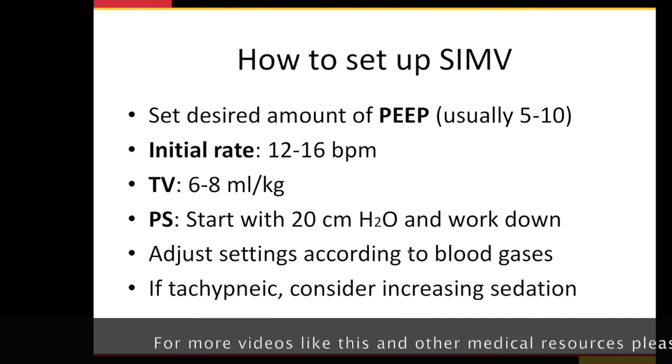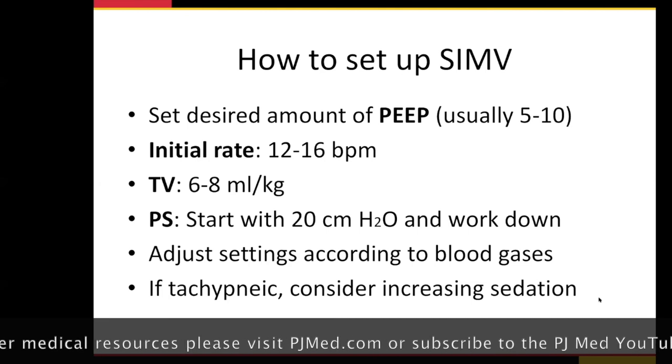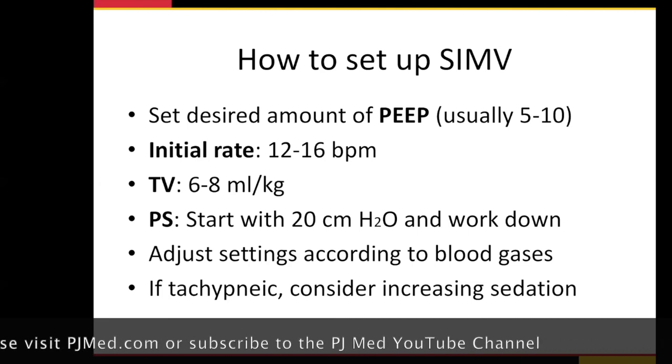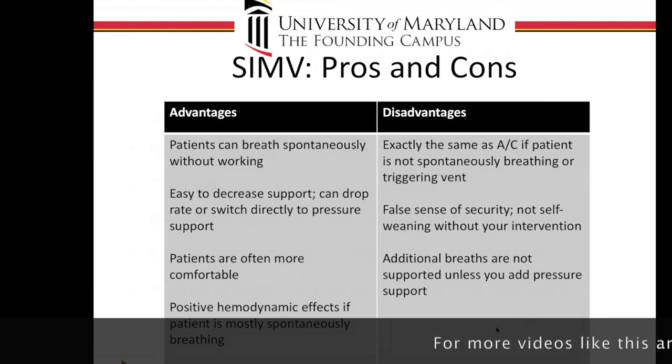So you have to really think about sedation when you're doing all this, because that's a really important piece of all this. Separate talk, but important piece. So, pros and cons. This is a good mode. It's not an automatic mode. You're not going to automatically wean off the ventilator if you're getting better.